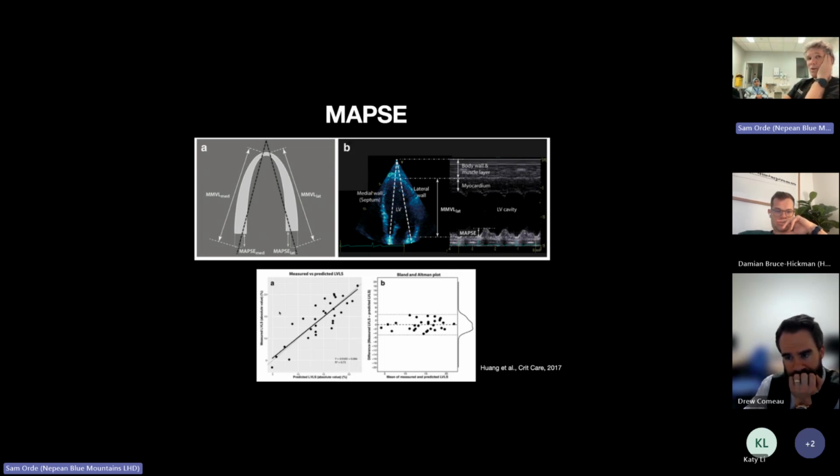And particularly, why do we care if it's like global longitudinal strain? What's the advantage? The LV contracts. Okay, coming on to that. What do you mean by that? It's more from base towards apex.